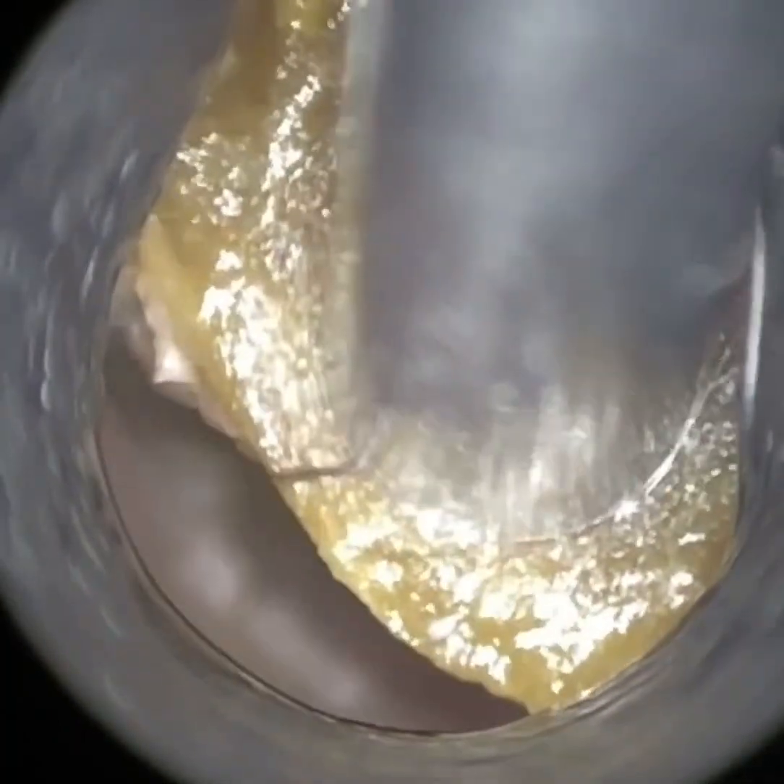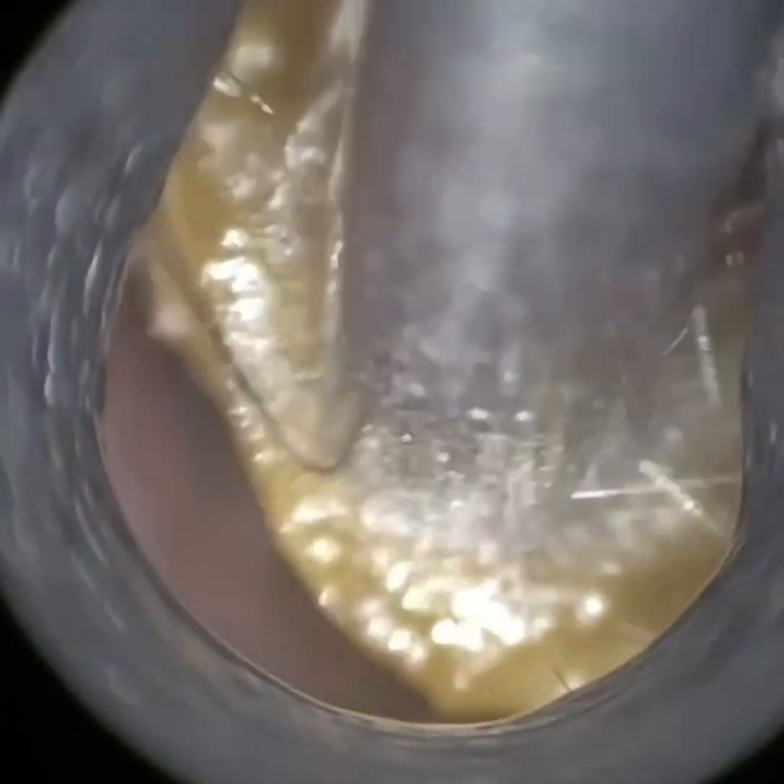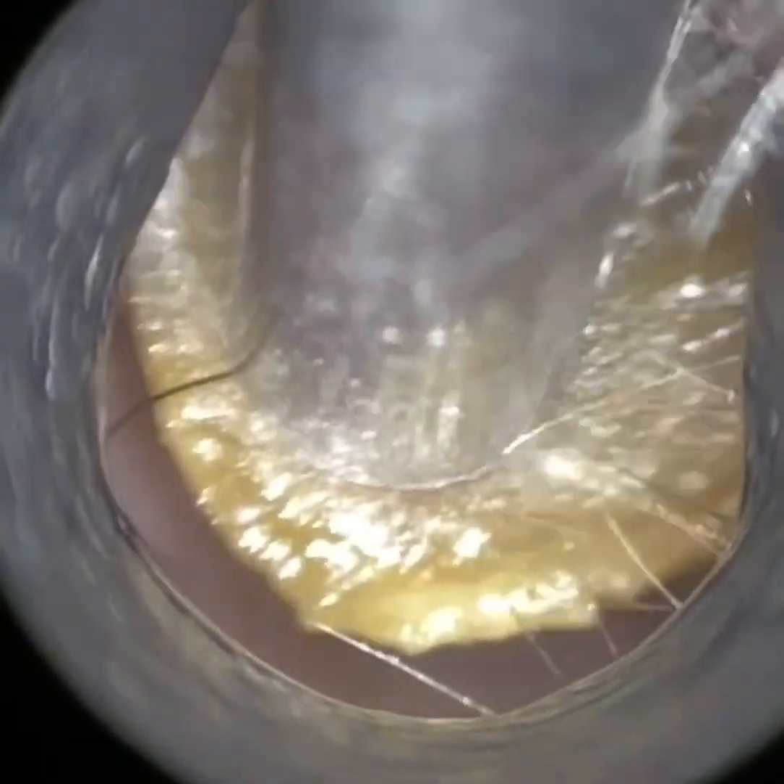So the patient has a really, really narrow bendy ear canal, and as you can see, there's some more kind of crusted keratin wax here that I removed.